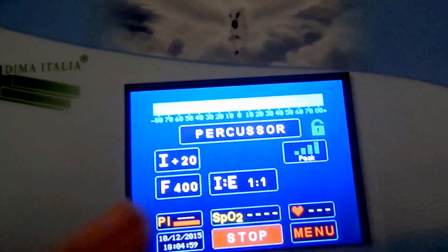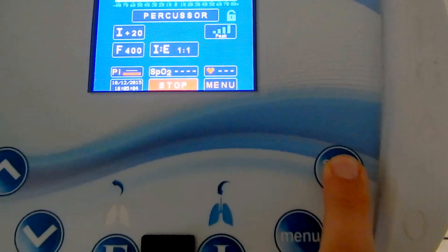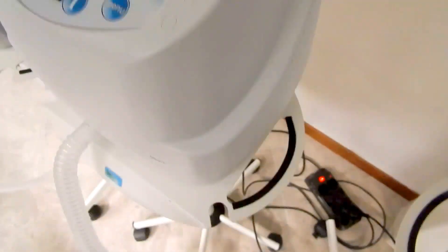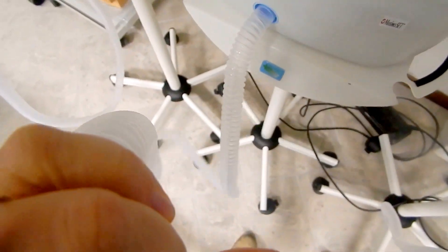The operator can also choose the IE ratio. Let me show you how it works. You can see the characteristic movement on the tubing due to the percussion.